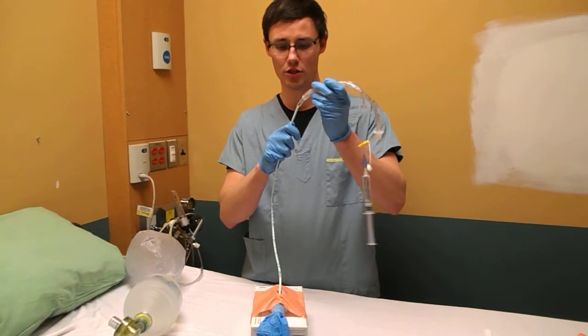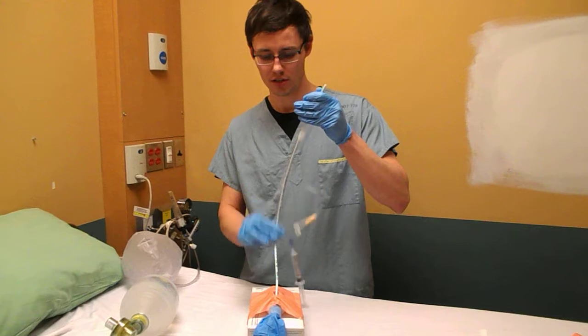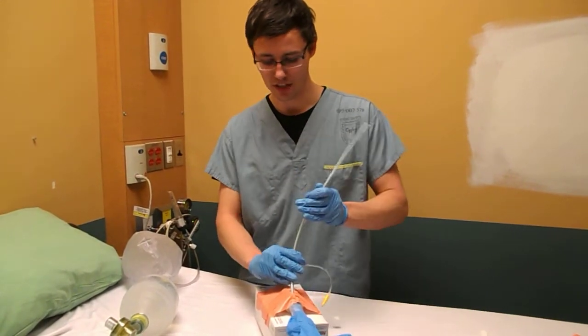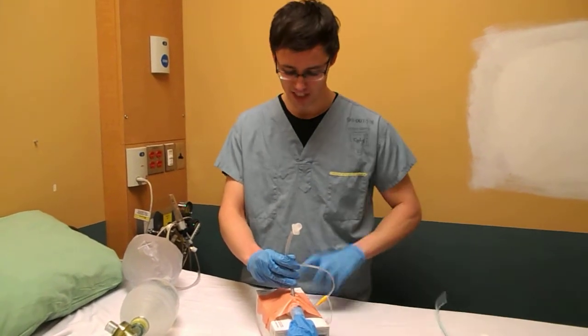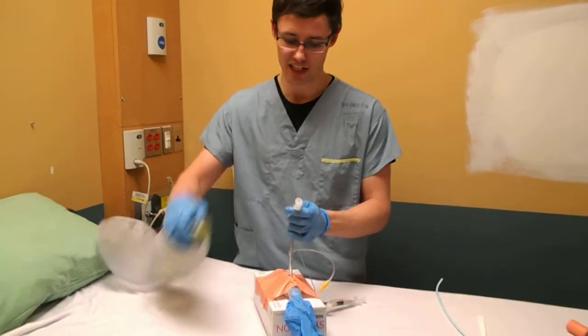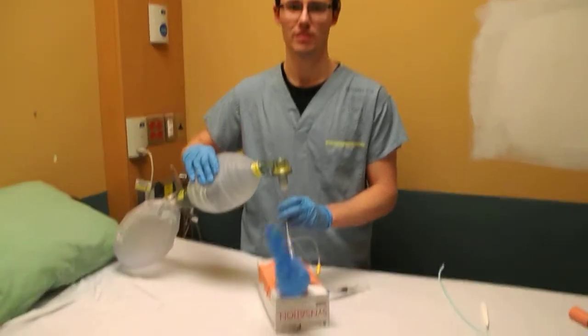Next, 6.0 ET tube, slide that down. You're going to have an assistant hopefully to do this, but if you don't, this is the one-man technique. ET tube is in, have your syringe attached, cuff up, attach your bag — save a life.